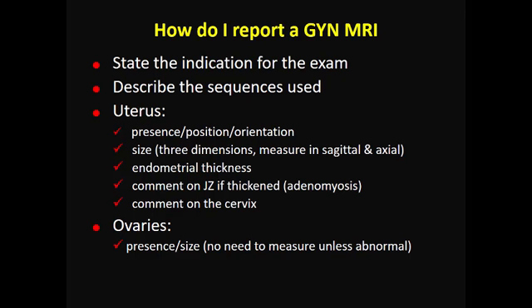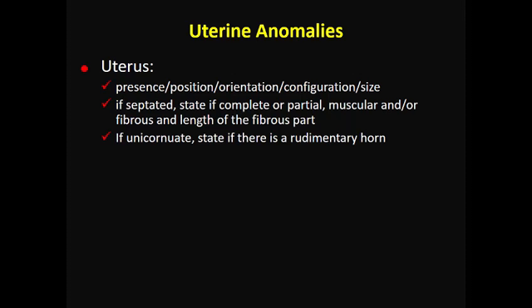And just a word on free fluid, because we overuse the word ascites all the time. If there is a small amount of fluid in the pelvis, especially in premenopausal patients, you don't have to say there is ascites present. Ascites has a pathological connotation, meaning malignant cells or, if non-malignant, due to a pathology. So I use free fluid in my report.